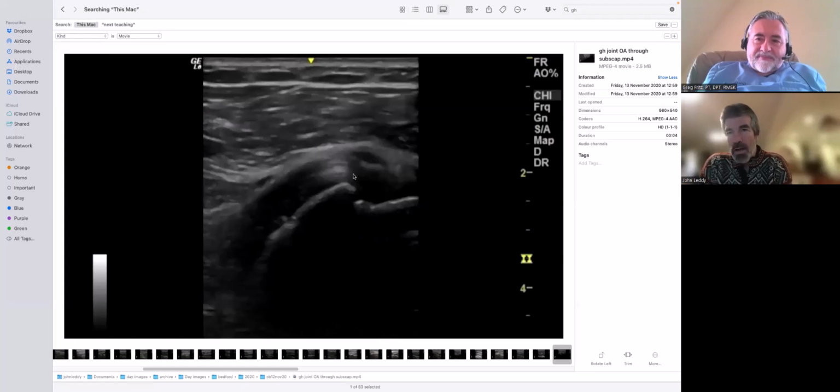Now, one day someone will find something and they'll have some measure, but in my hands and in anything I'm aware of, people use ultrasound to assess for thoracic outlet syndrome, and there may be some merit in there. But I can't think, unless you're looking at a specific vascular thing, and there are vascular tests for it, but unless you're doing those routinely and seeing patients where it's appropriate, I can't see that anyone practicing like I am, or I suspect like you are, is going to see anything useful.